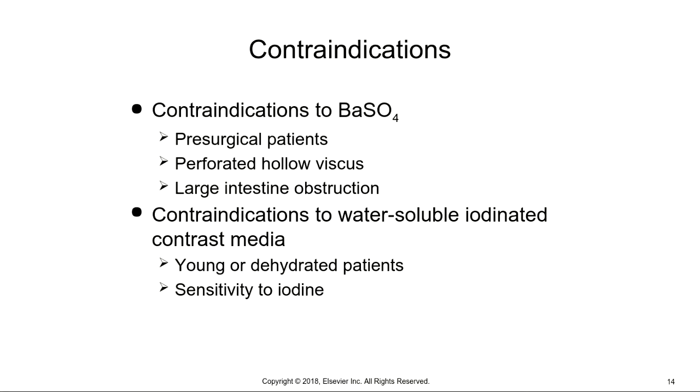Some contraindications to a patient having barium. We've talked about this before. If they have a possible obstruction, if they have a possible perforation, and if the patient is pre or post surgery within 48 hours. I recognize that says pre-surgical, but it could also be post-surgical. And remember, if they could not have the barium, then they would have the water-soluble iodinated contrast.